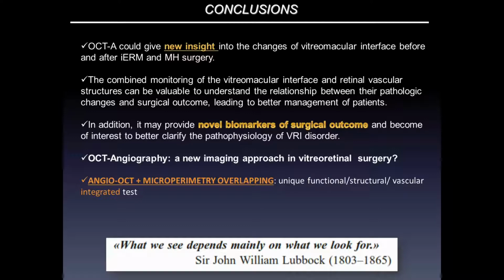In conclusion, OCT could give new insight, also in particular fields like the problem of the vitreoretinal interface before the surgery. In addition, it provides novel biomarkers of surgical outcome, because you have to tell your patient the prognosis of their problem. Maybe the overlap of microperimetry, a functional exam, with the aspect of anatomical perfusion of the vessels of the retina is a unique functional, structural, vascular integrated test.